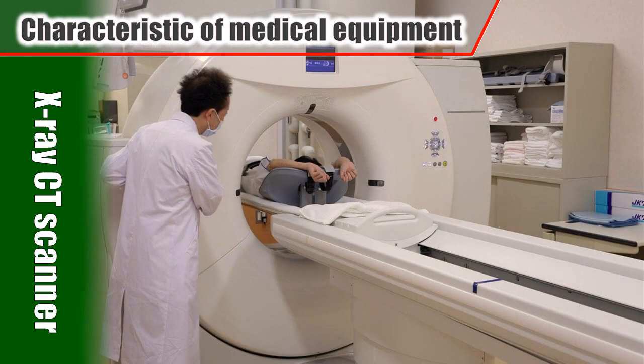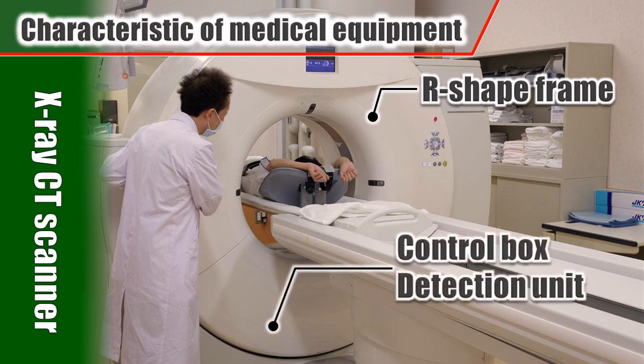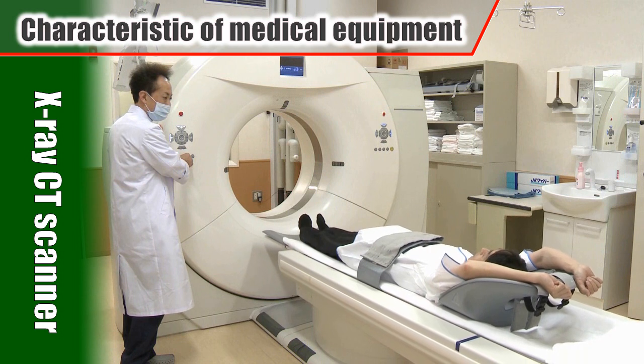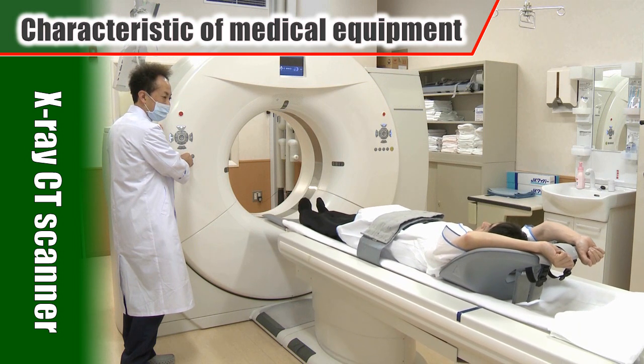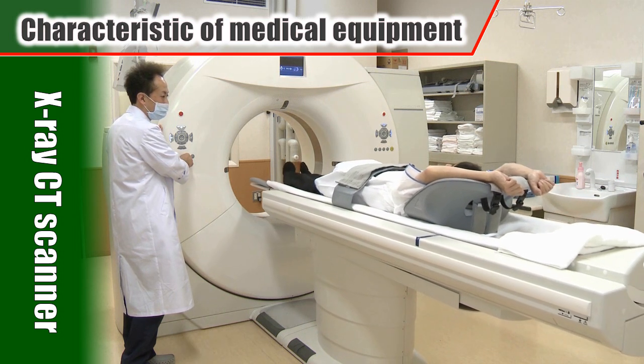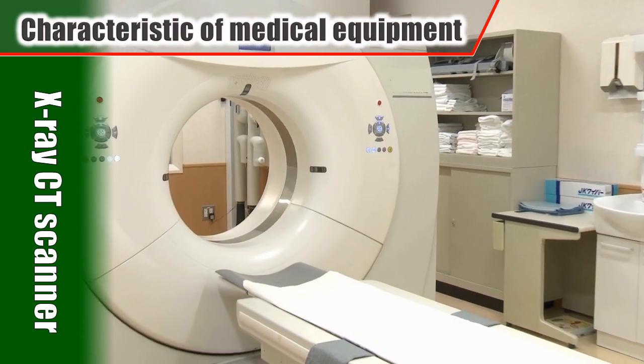Next is the X-ray CT scanner. Inside of the distinctive R shape, we find galvanized steel sheet metal structure frame and aluminum machining processed frames. It also has control box and detection unit with many rivet structures. Galvanized steel is the most used material, and structured steel is also used for the cradle or bed parts. Stainless steel and aluminum are hardly ever used. The exterior cover uses many plastic parts.